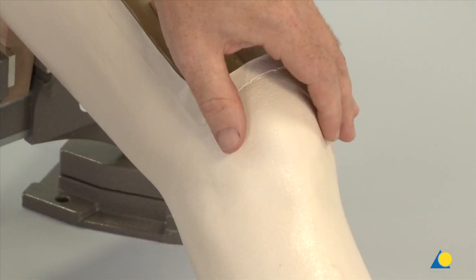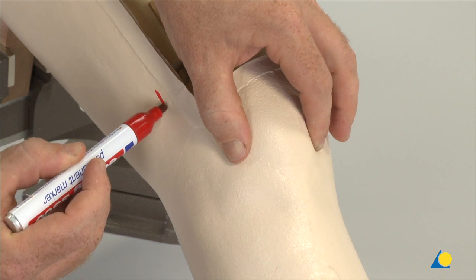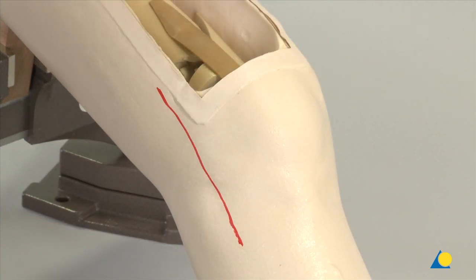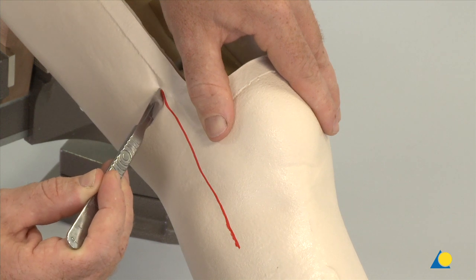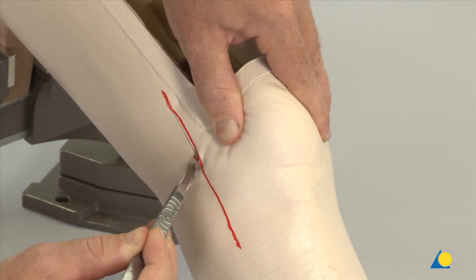In the presence of a complex intraarticular fracture, a 3-3-C2 or C3 fracture, a lateral parapatellar approach is made. An arthrotomy is performed to expose the joint for reduction. The incision is extended for adequate exposure of the joint for anatomical reduction and fixation.